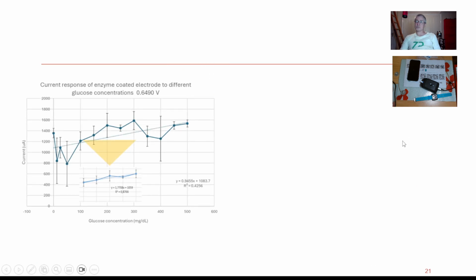So we're talking about continuous glucose monitoring. The first thing is, great set of slides, but you're really not showing me the raw signal. What you are showing me is an extraction from the raw signal. In this case, you've extracted current, and you're showing me current versus glucose concentration. But in fact, that's an extraction. Below there's actually raw signal.